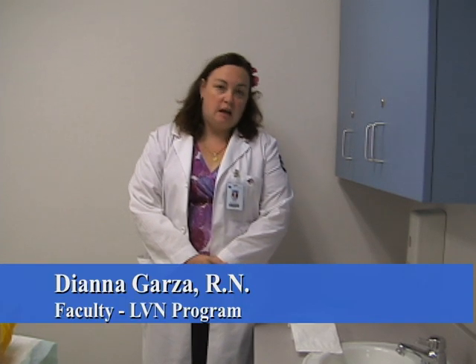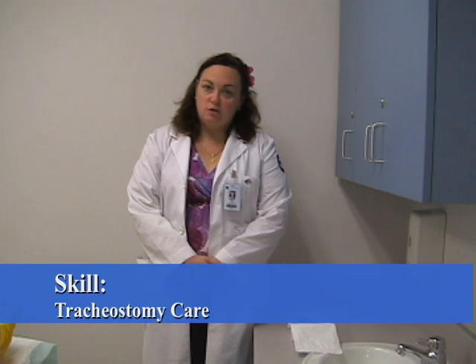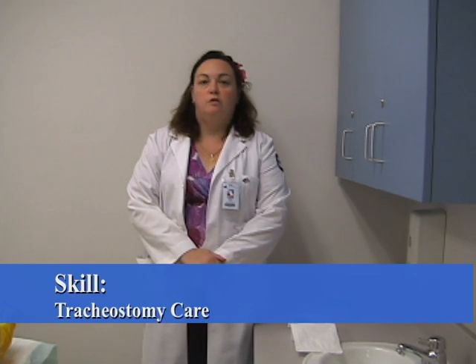I'm Diana Garza and I'm going to be demonstrating tracheostomy care in a patient. Each facility has their own policies regarding tracheostomy care, so I will refer you to the facility's handbook on policy and procedures so that you follow their rules correctly.